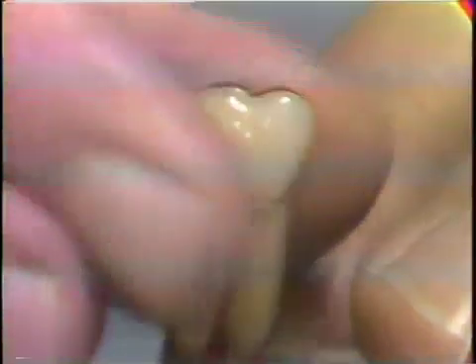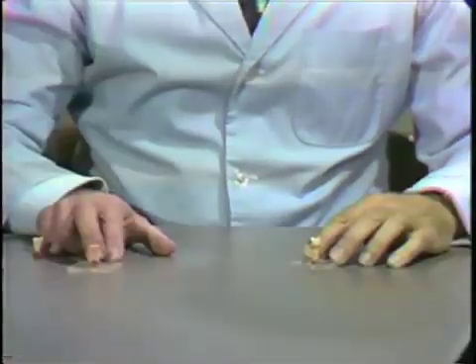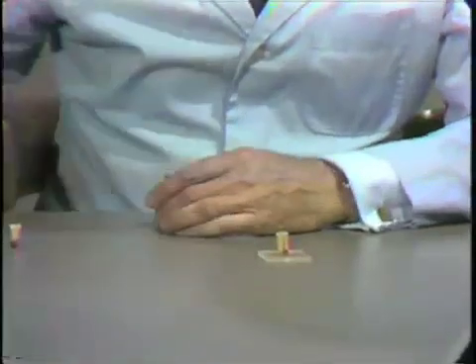And this one has on it a veneer crown with a resin facing, which you see in that situation. This other model shows an earlier stage in the preparation, and you can see on this one the pins going into a vital molar tooth. And as we take a look at it closer, it looks perhaps a little untidy. The pins are sticking out at all different angles.